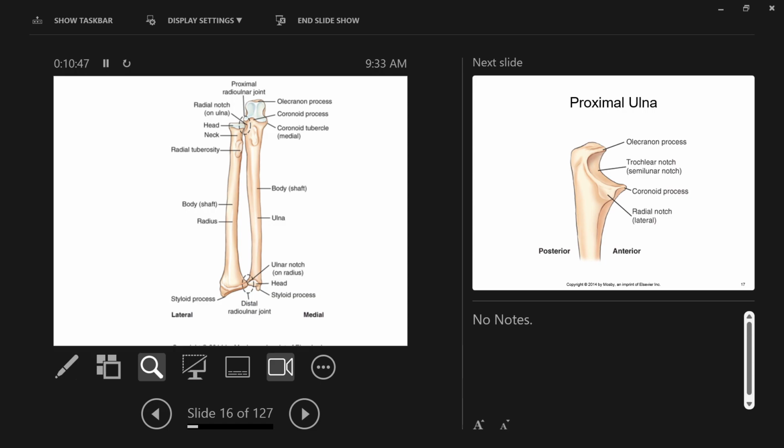He dislocated his elbow. But anyways, you can see this open line right here, this dark line. And then past that is bone, and on the other side of that is bone. That's an epiphyseal plate. Open in children, shows up dark. And if that's the ulna we're looking at in the elbow up here, down at the wrist, there's also one. So at the end of every long bone, there's this line, this plate, this open area where the bone is growing from. That's how our bones grow in length. They don't grow from the very tip of the bone. They grow from somewhere towards the end.